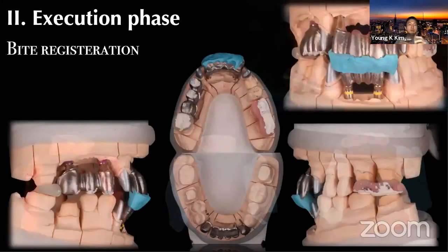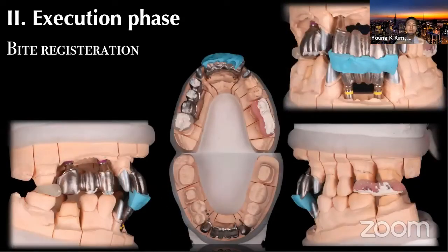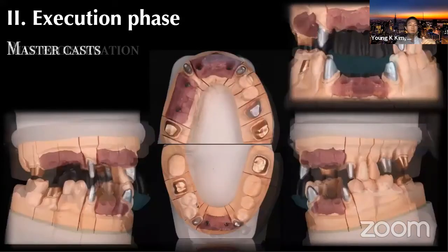So therefore, sometimes when you do the try-in, I re-verify my bite, in this case a PFM framework. I use zinc oxide eugenol to get a much finer type of occlusion on the posterior, and then re-verify your bite and see if what you've attained is the same at this moment in time with the framework. So occlusion, the bite registration, doesn't mean that you take it and finish. You continuously re-verify whenever you're moving on.